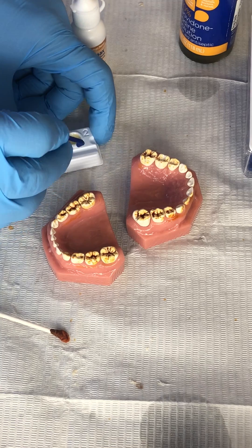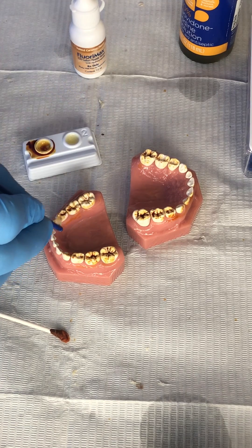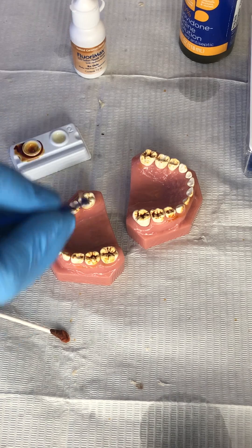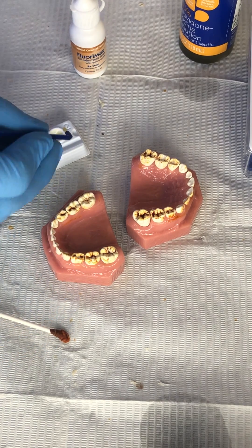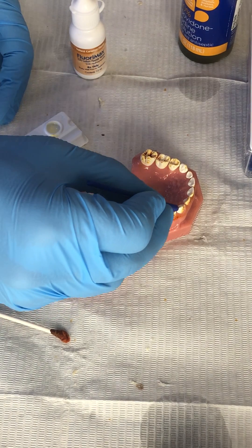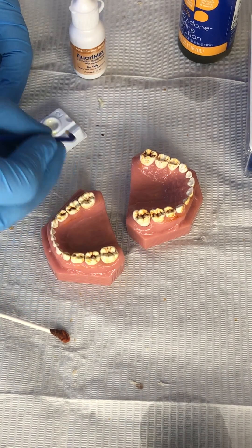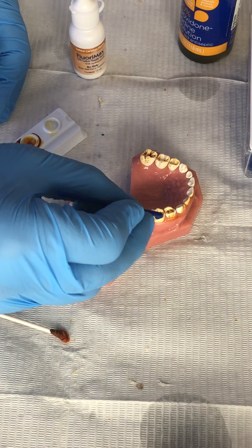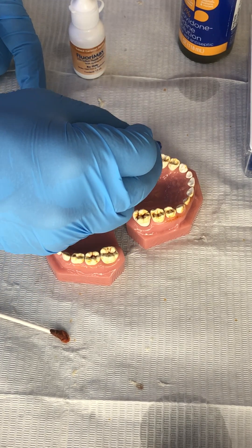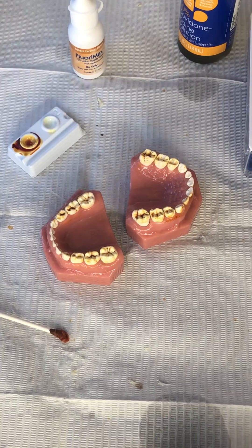You can do this by quadrant or the whole mouth, whatever you like, and then you cover with varnish. Can you use a thicker varnish like the traditional ones? Absolutely. Can you use a thinner one like this shellac that has half the concentration of fluoride varnish with the same release as other fluoride varnishes? Sure, whatever you like.